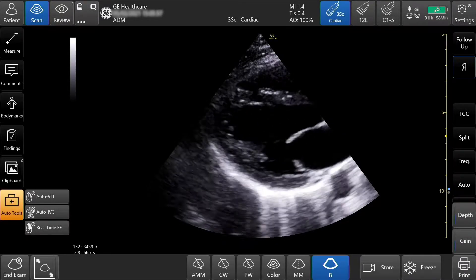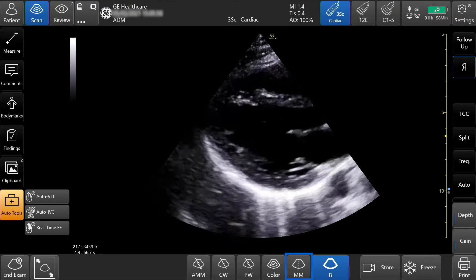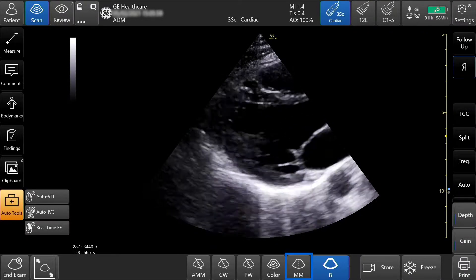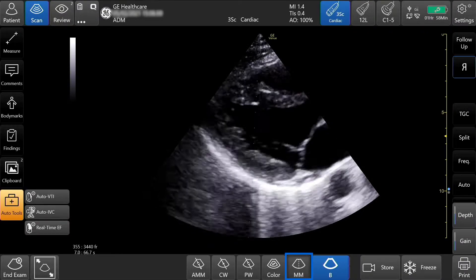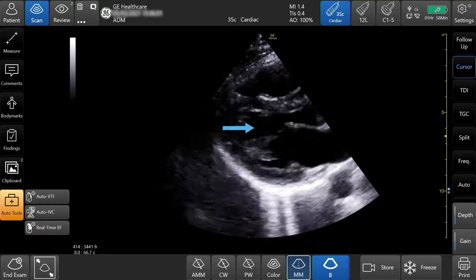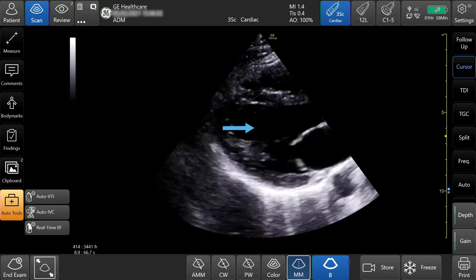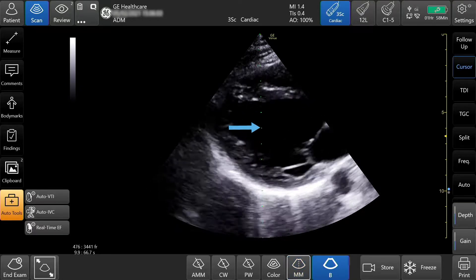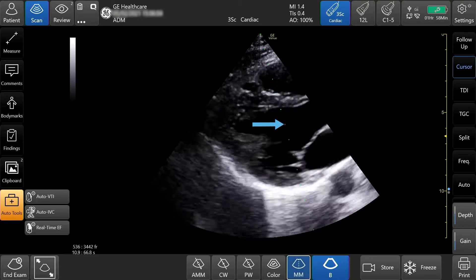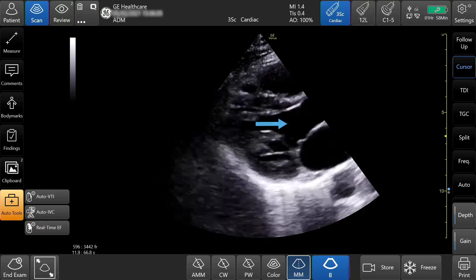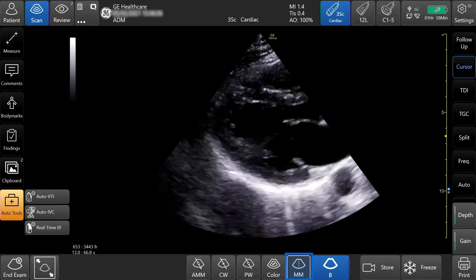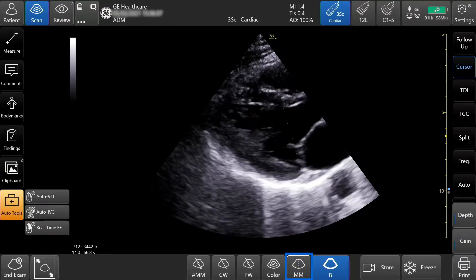To activate motion mode, tap MM on the bottom of the screen. Press and drag the cursor into position, then tap MM to update motion mode.